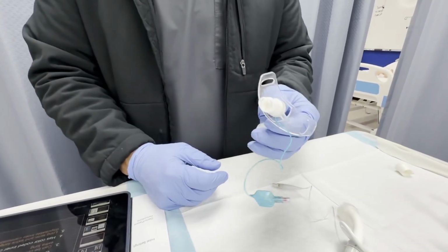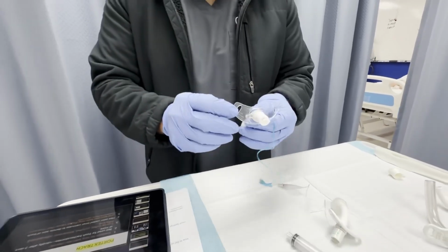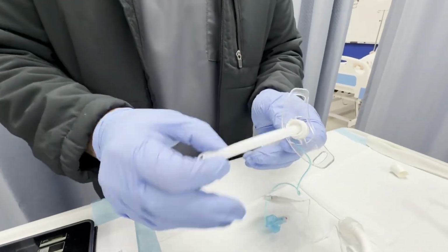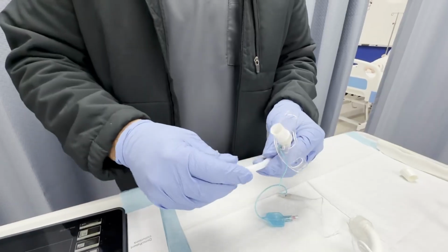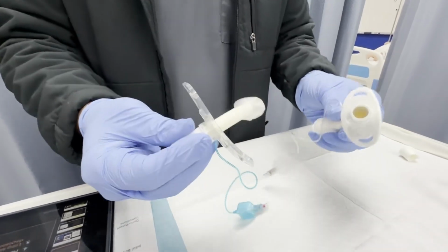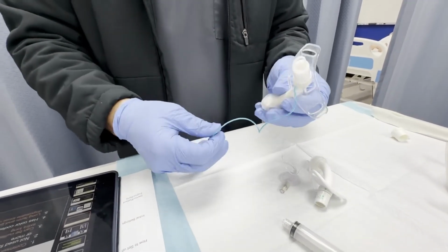They wouldn't put this trach in initially. This would be something that they would put in afterwards, so they can go home. You can live a lifetime with this one. The flange is more flexible. It's clear. The difference on this one is that the inner cannula is usually not disposable, so you've got to take these out, clean it, and reuse it. They're color coded too for the different sizes. Both of these can come uncuffed, cuffed, fenestrated, non-fenestrated, whatever the patient needs.